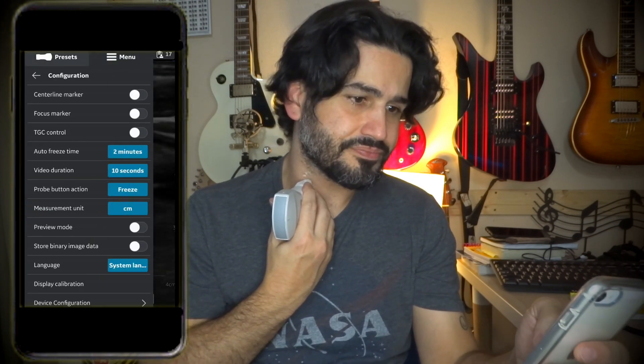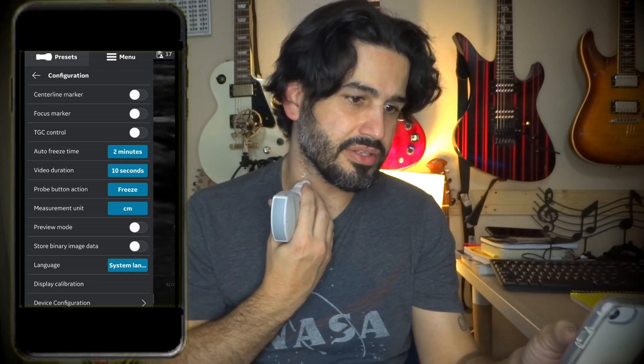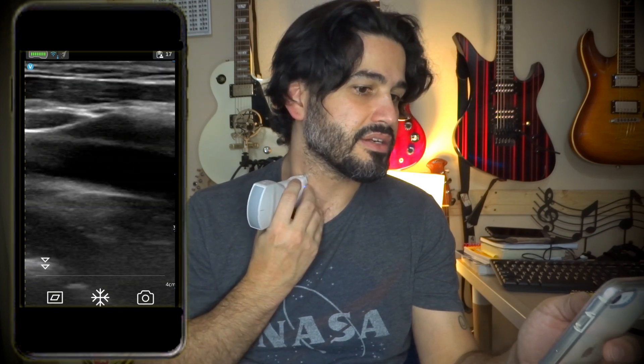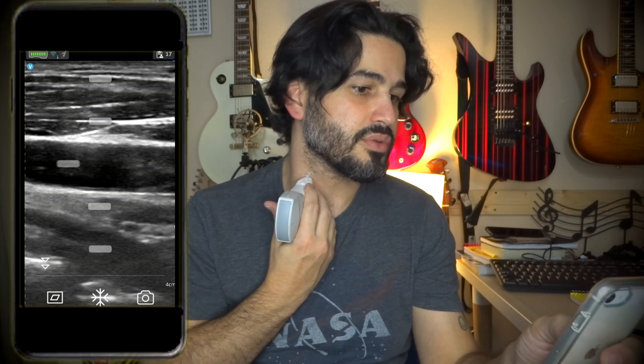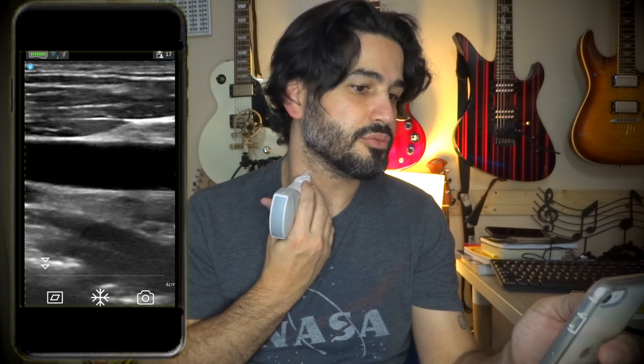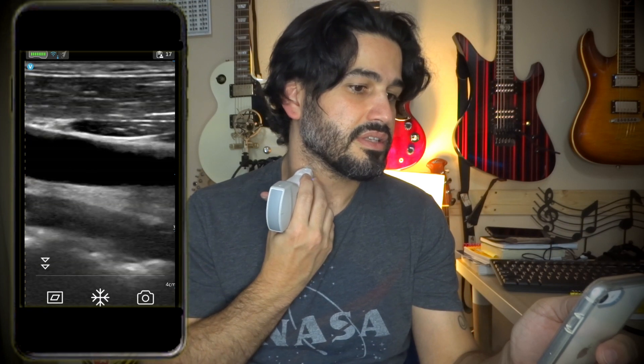It does have TGCs. If you go to the left upper corner you can go to the menu, then configuration, and hit this little marker — this is TGC control. When you swipe, there you go — TGCs. So if I want to clean up that carotid I can swipe and remove the TGC. Look at that — super clear. That's awesome.